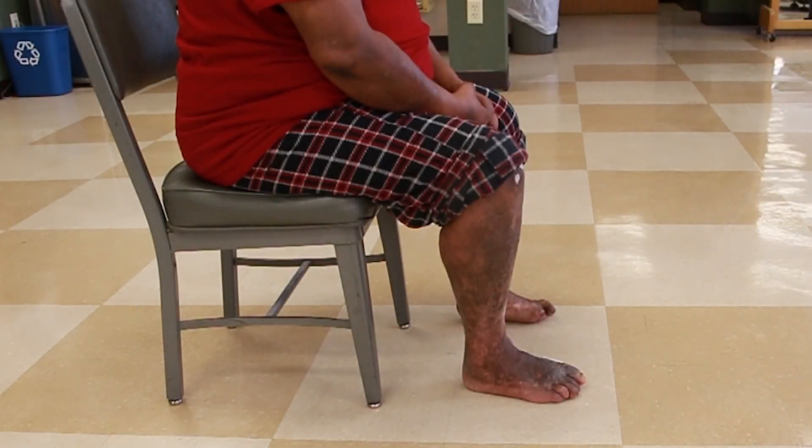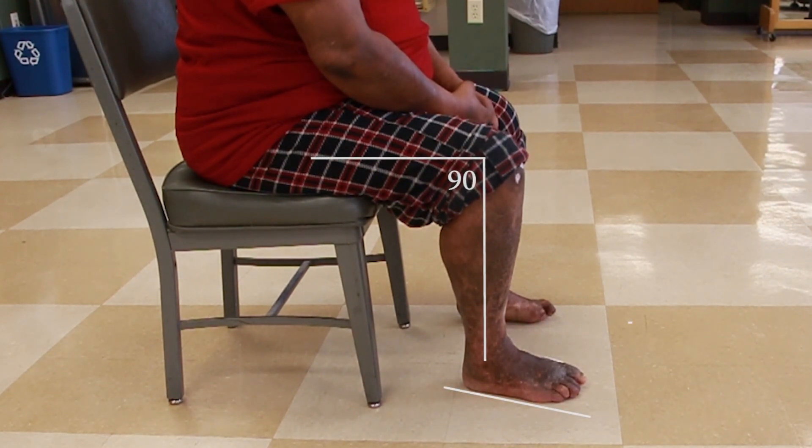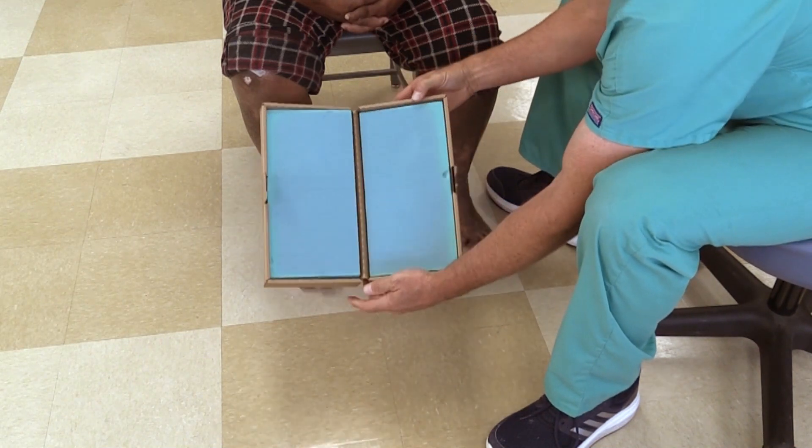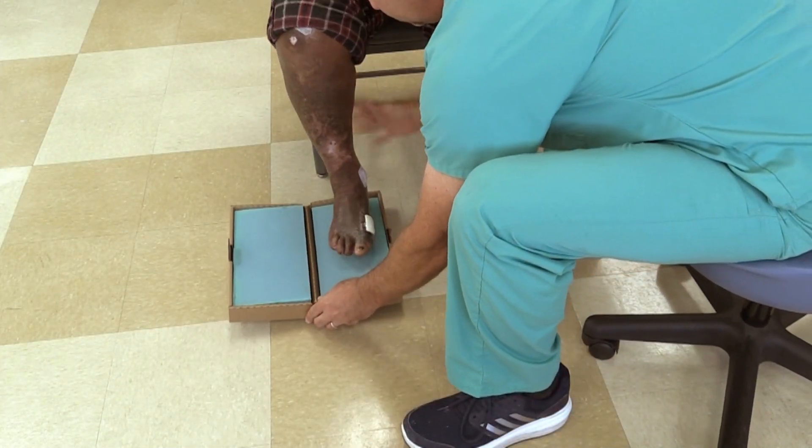Make sure the patient is in a comfortable sitting position with the knees at 90 degrees and the feet flat on the floor. Open the foam box and place one side under the foot while leaving the unused side of the box on the outside of the foot.